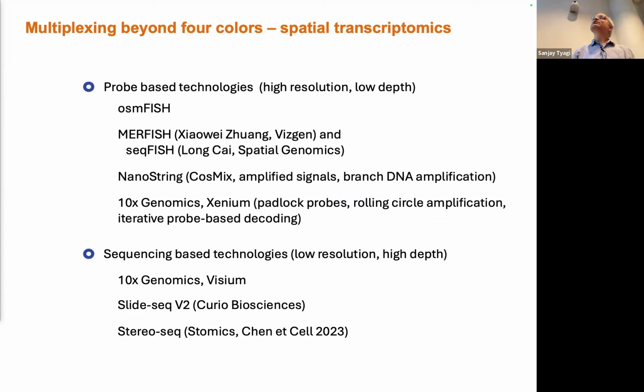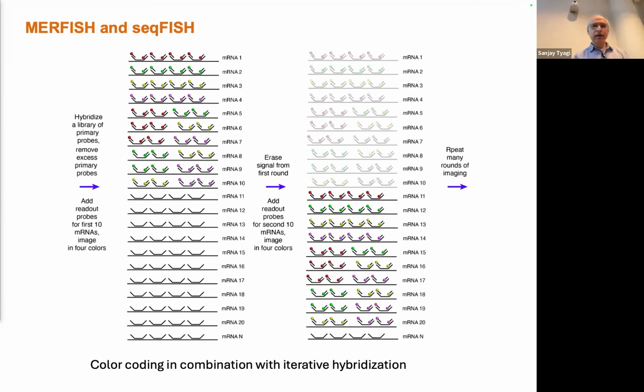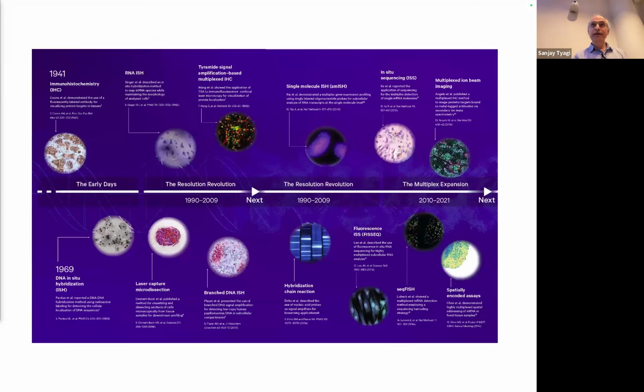You also take an image of the section with DAPI or H&E, and since you know the XY location of each bead and therefore the barcode, you can link the two, and it's pretty compelling. All these technologies are limited by how good your segmentation algorithm is.